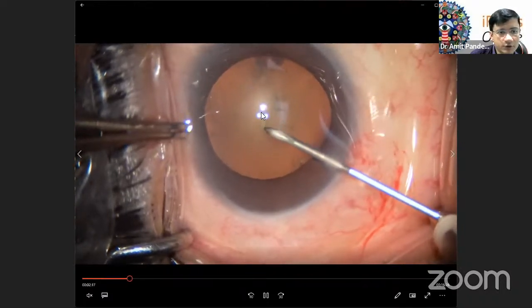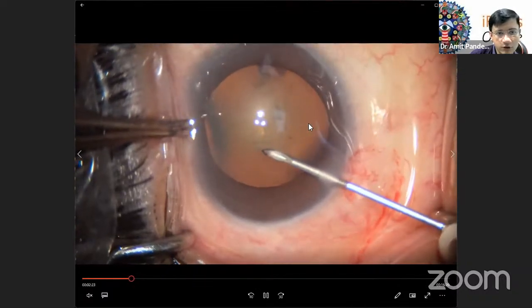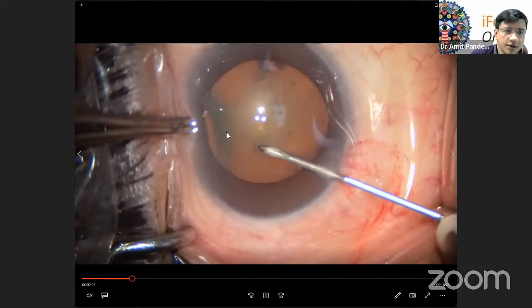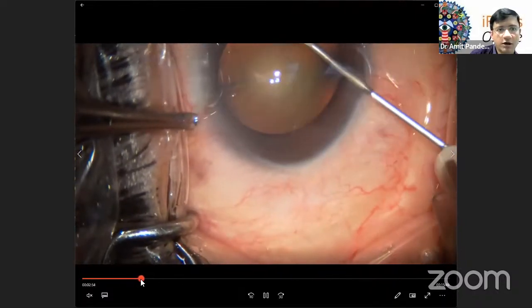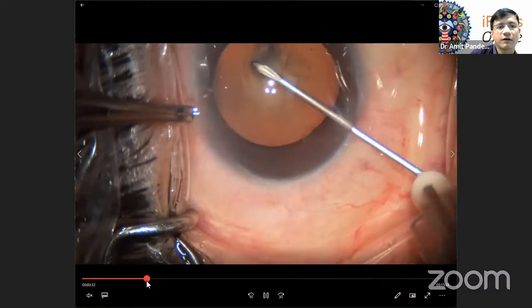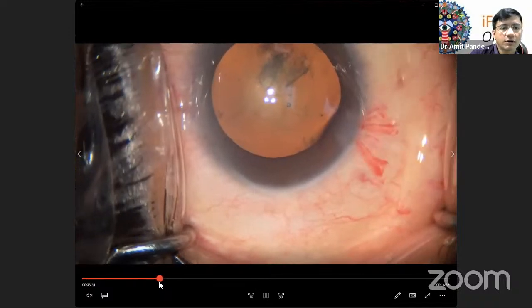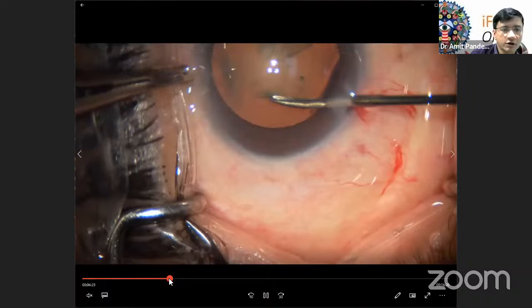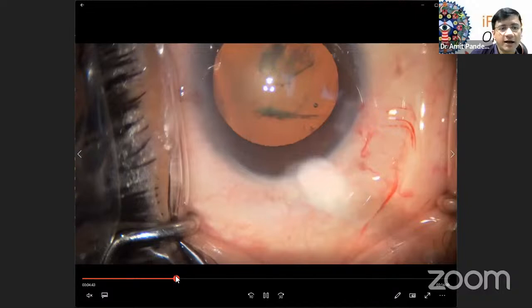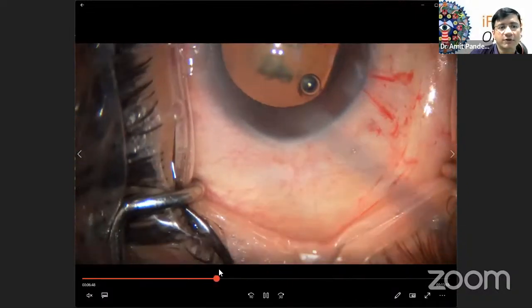What I did was to make a half rexis here, because the zonules on this half were not as many as on this half. So I could complete half rexis there. Now it will be very visible. And then I took a micro rexis end grasping scissor, and made a flap there. And then I came with a forceps and tried completing the other half.